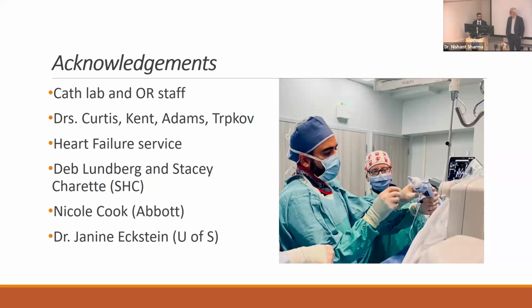So I think the biggest issue is, how does the device interfere with a previous repair? Sometimes the anatomy changes completely after that mitral valve clip is placed. So we have limited experience. There's not a lot of data out there though. And some of that new data that's coming out that I mentioned may highlight some of that gap in knowledge.